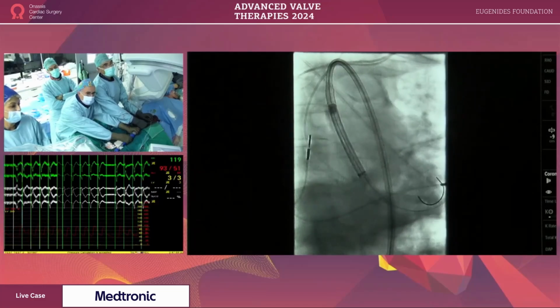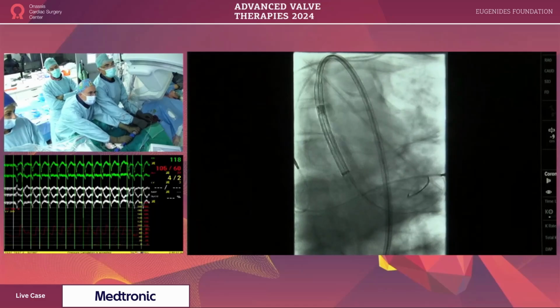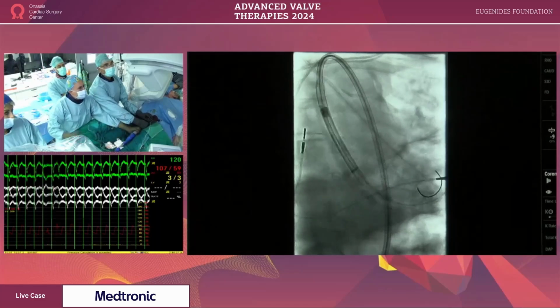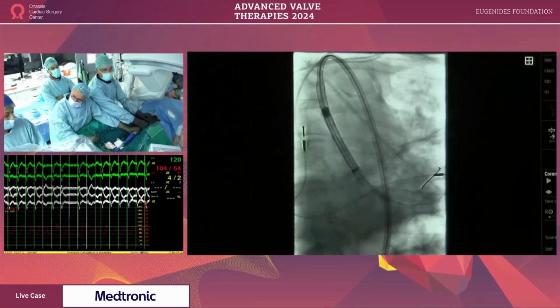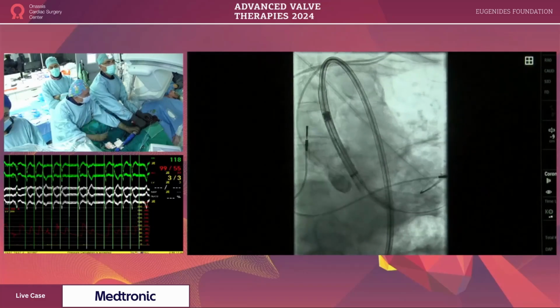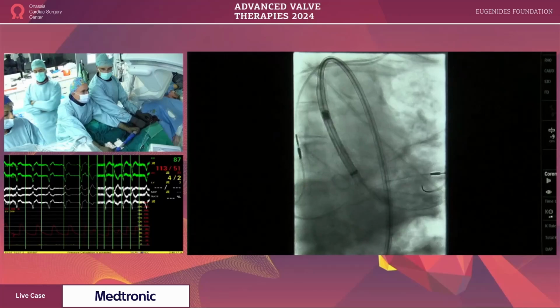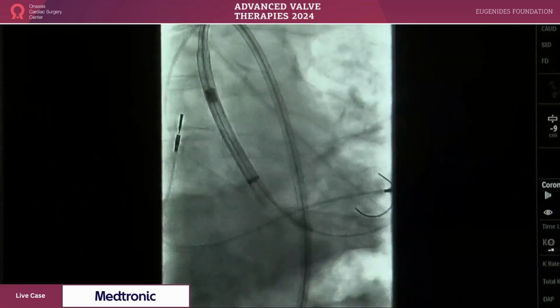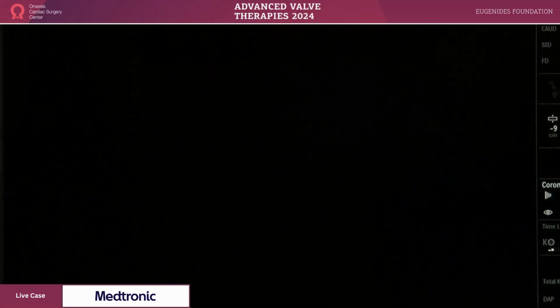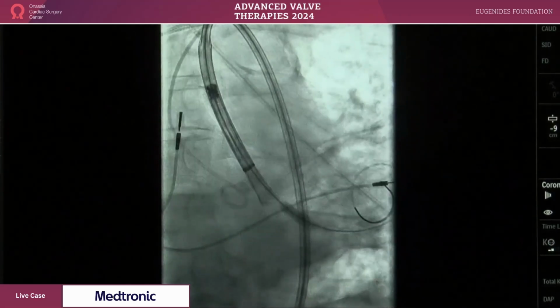So unfortunately, the sedation, as you see from the comment of Dr. Weiler, doesn't help sometimes because the patient is snoring. So you've got to magnify. You've got to be able to say, okay, pace faster now, pace faster, and keep opening. And again, more dye. Give it again dye. You need to spend the dye because it's been too many times that it came up. Inject.